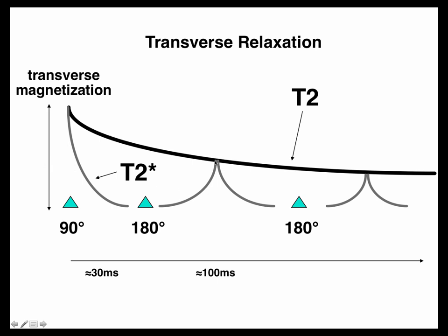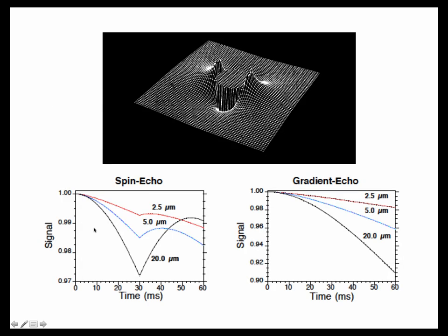And the amplitude of that signal is proportional to the T2 of the signal. And that is less sensitive to various signal dropouts as well, like macroscopic large dropouts at the base of the brain. They all become refocused, or mostly refocused, by the 180. So there's an advantage there as well. T2s are generally about 100 milliseconds, T2 stars about 30 milliseconds.